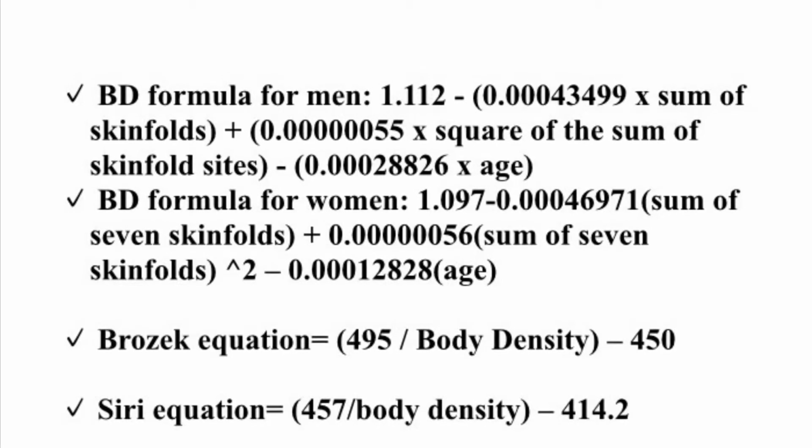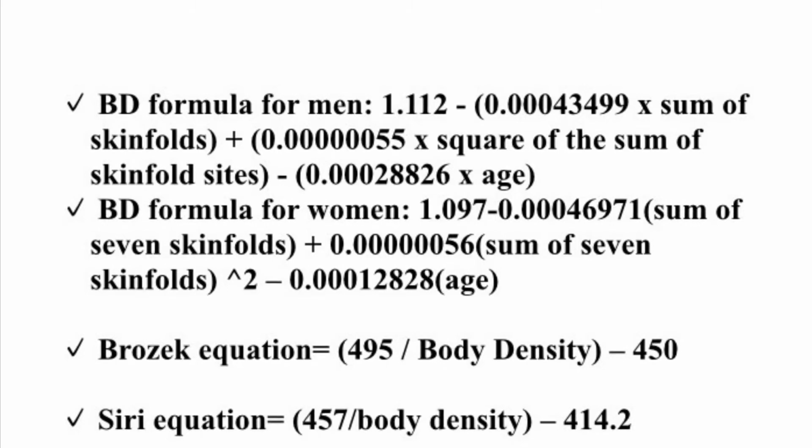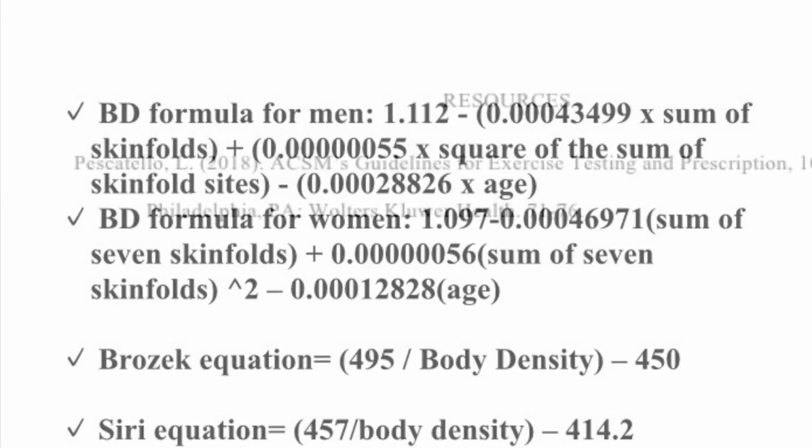Retests are only to be administered when measurements are not within 1 to 2 millimeters. You should take 2 measurements on each site, but rotating appropriately through each one first before moving on to the second assessment.